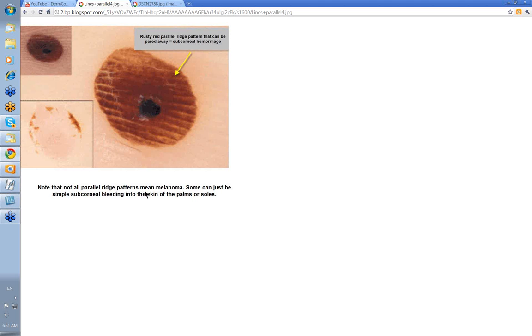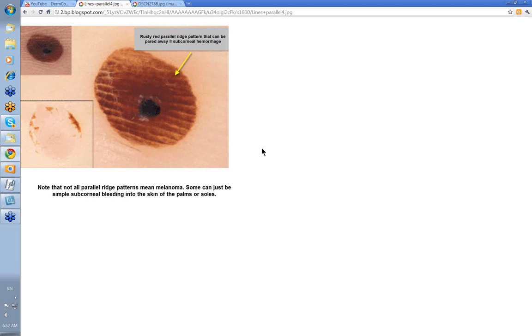The point here is that not all parallel ridge patterns mean melanoma, so don't go excising one of these because you think it's a melanoma. Take a 15 blade and just gently pare the surface and you'll see it all comes away — simple sub-corneal bleeding can give a parallel ridge pattern as well. Look how well defined it is at the edges here compared to the more diffuse edge you'll get with some melanomas. Always have your 15 blade handy. Parallel ridge, parallel furrow patterns — lines parallel. Thanks very much.